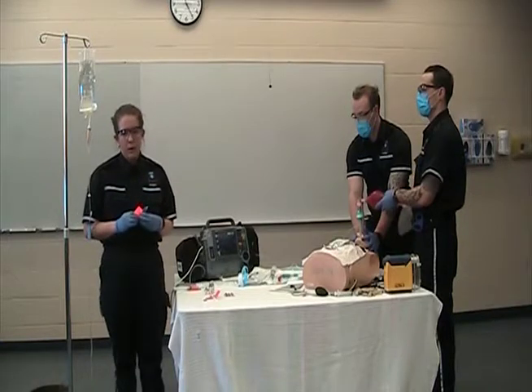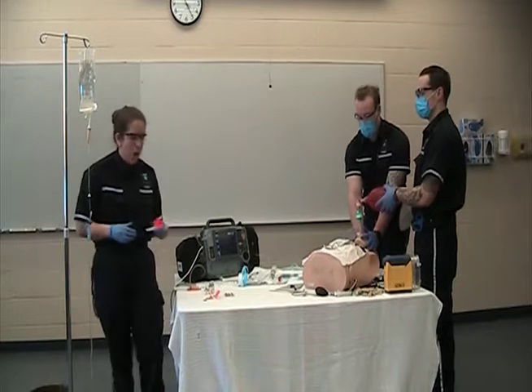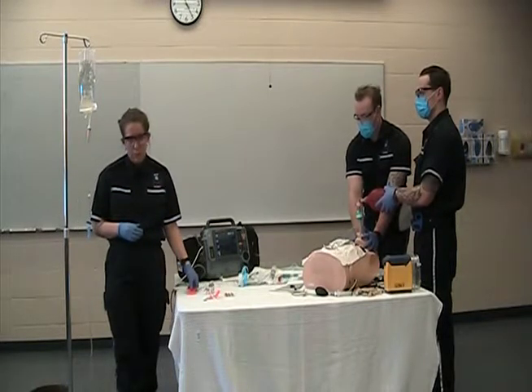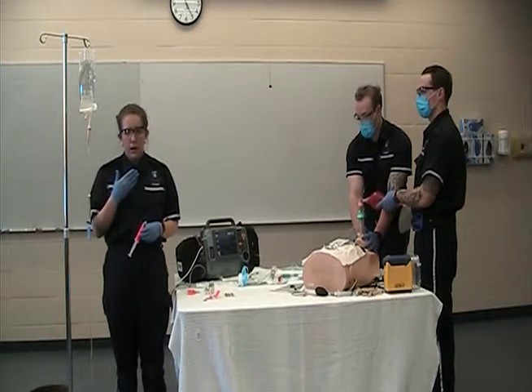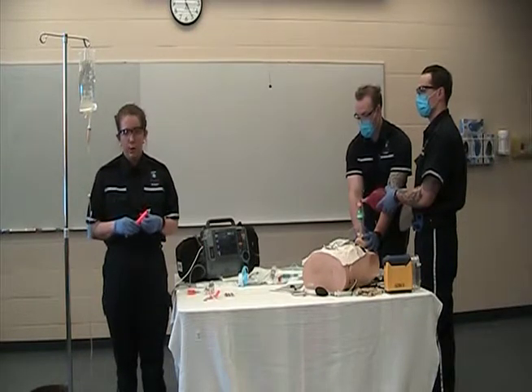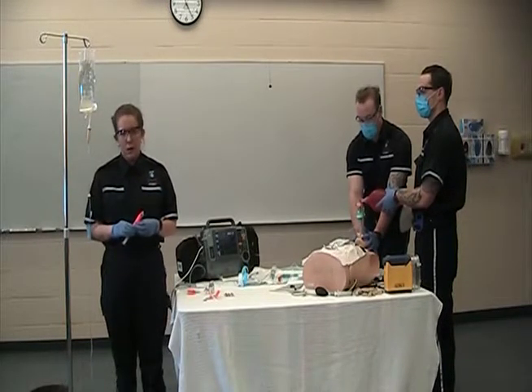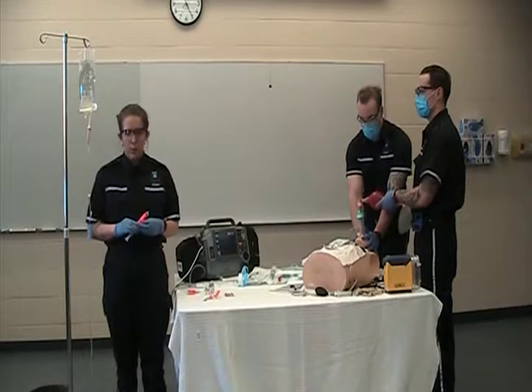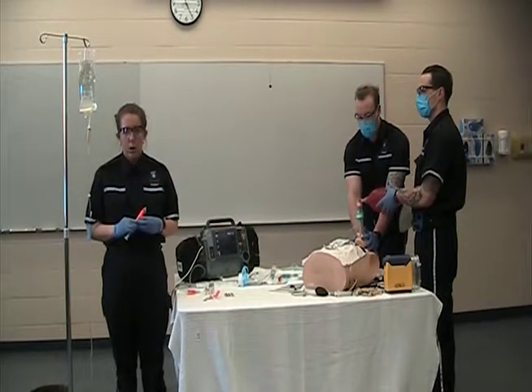After we've successfully placed the ET tube, we want to do a maintenance of paralysis and sedation as well. We don't want our patient rejecting the tube in any way. Signs of rejection of the tube include tearing, bucking, hypotension, hypertension, and tachyarrhythmias. For our maintenance of paralysis and sedation, we're going to be using ketamine again. The dosing is 1 milligram per kilogram, so we're going to be giving 80 milligrams for maintenance. We don't want to be pushing any maintenance until we've confirmed that our ET is successful.